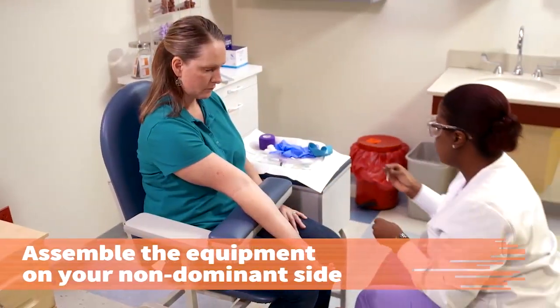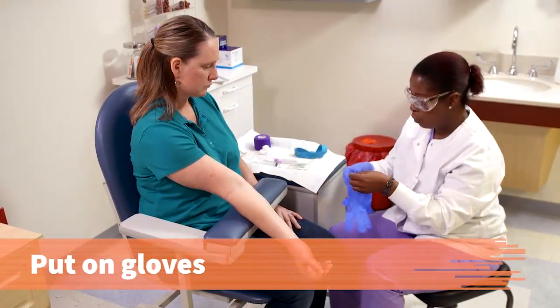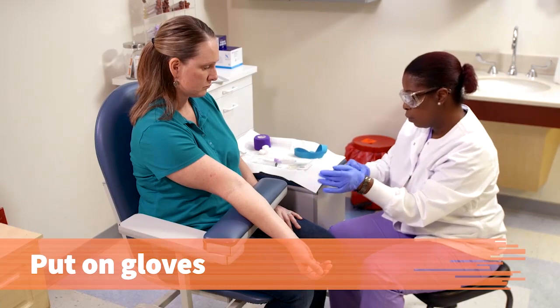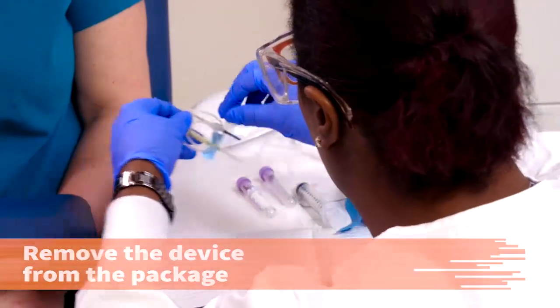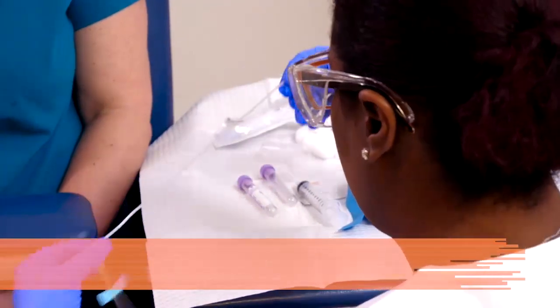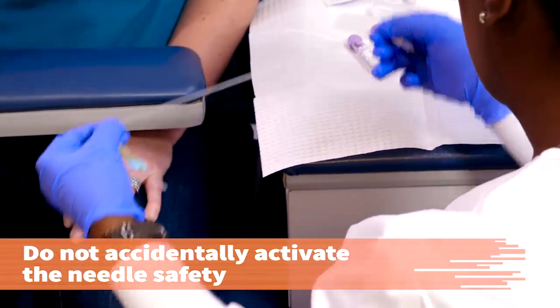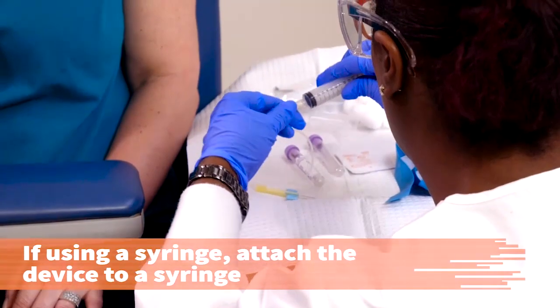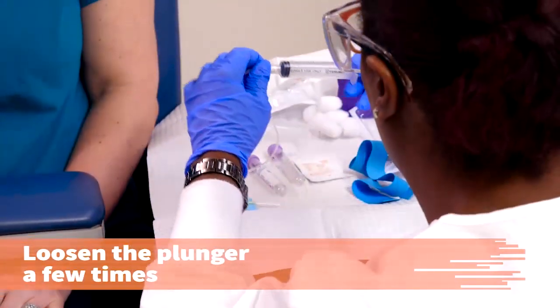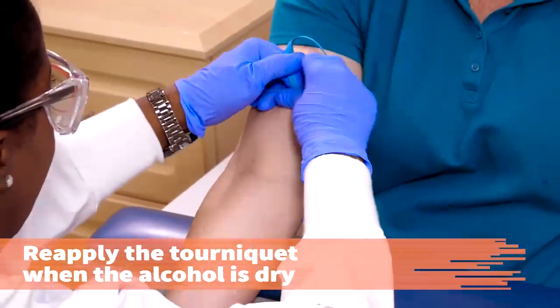Assemble your equipment and supplies on the non-dominant side of the patient's arm. Put on disposable gloves. Remove the butterfly device from the package and stretch the tubing slightly. Take care not to activate the needle retracting safety device accidentally. Attach the butterfly device firmly to a syringe. Make sure to loosen the plunger a few times after the butterfly and syringe are attached. Reapply the tourniquet when the alcohol is dry.